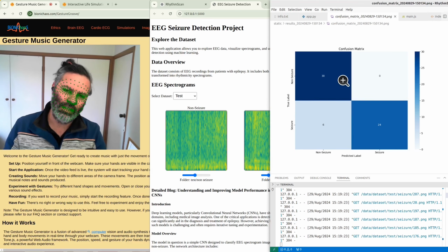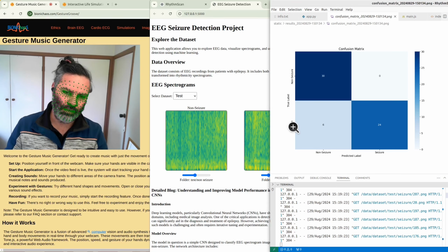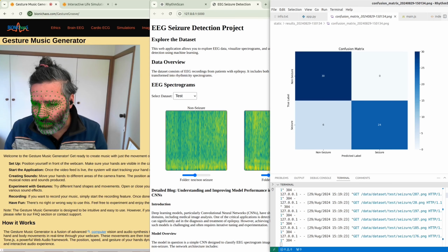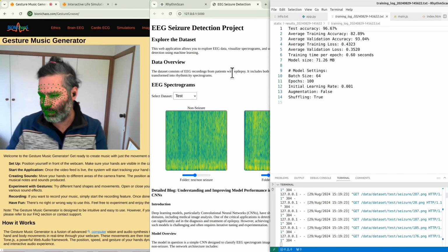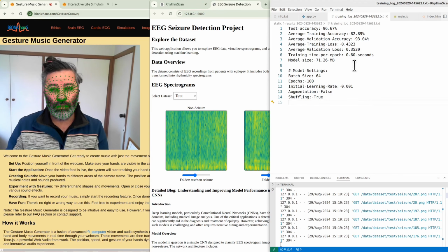When it's no seizure and the robot says seizure, that's a false positive, and we have 0 of those. And when we have an actual seizure but the bot is saying non-seizure, that's a false negative. And we get 6 of those in this case. We had a better one. Yeah, we had one with only 2. But in the results we'll just let you select, just scroll through them potentially.